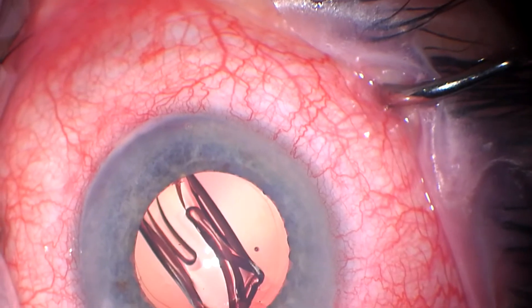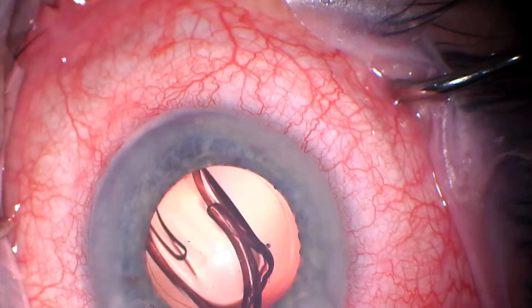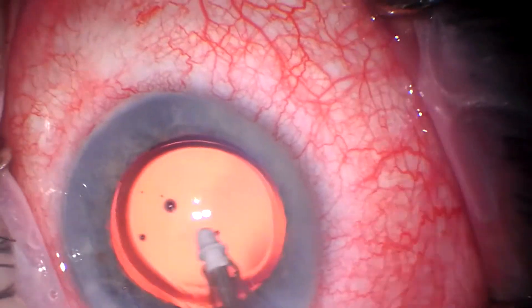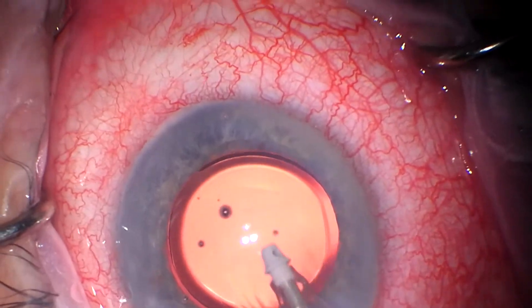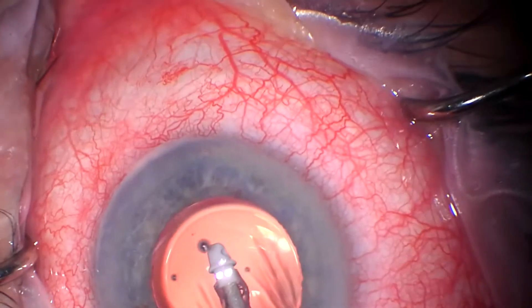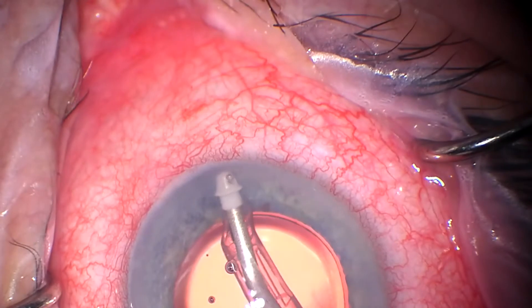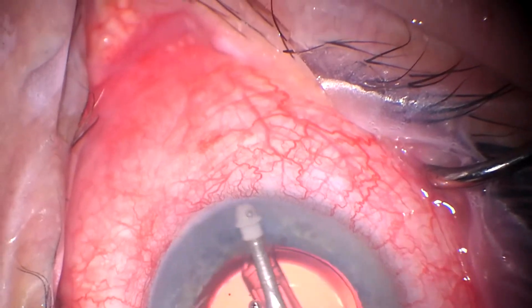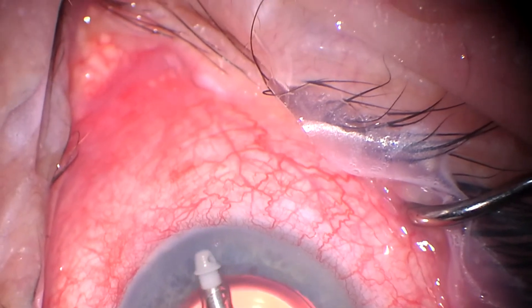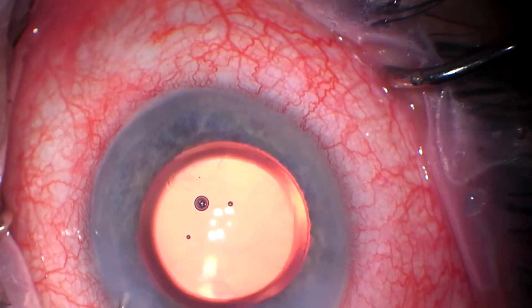Here is a Johnson and Johnson ZCB00 lens for this relatively young patient, where it will be largely glistening-free for life. Look for the fluid wave up top — you'll see some of those vessels blanch as I'm off the pedal now and then step onto the pedal. You'll see that larger vessel on the left side blanch substantially. So we do have good patency, suggesting good drainage.